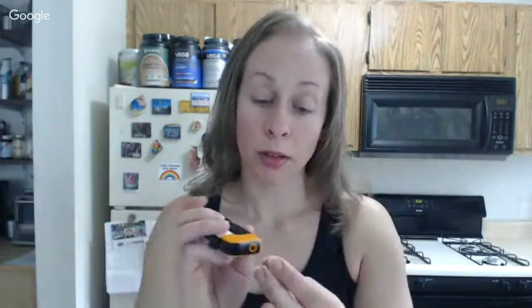I always wash before. That's a huge important thing, or use an alcohol swab. But anyway, this here brings back the lancing device. Test. Tiny little drop of blood. I don't even know if you can see it. That's actually too much for this meter, honestly. So just put that in there.